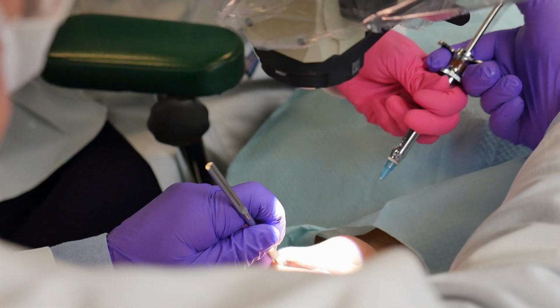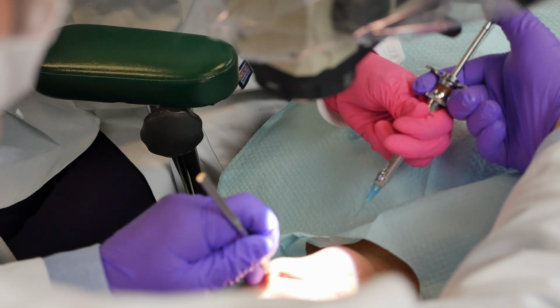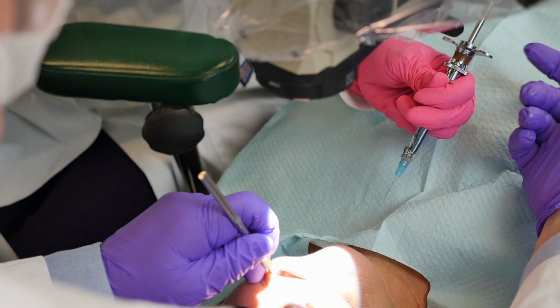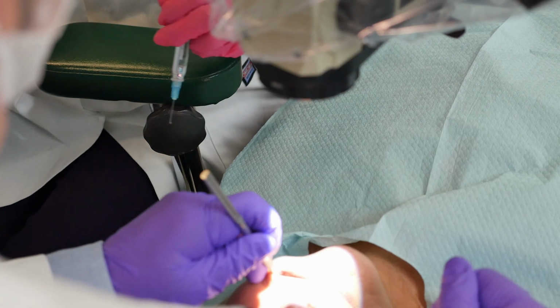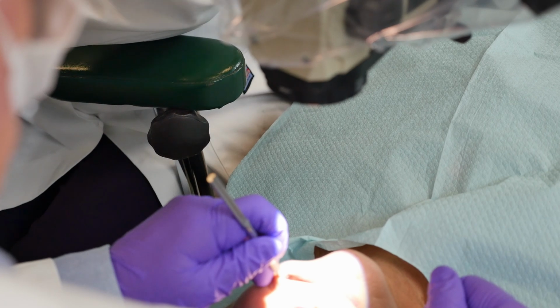If you look at the return of the syringe, here's where the error is. Now, when you look at it in slow motion, I am supposed to keep my hand steady until Joy moves. And you can actually see how when she grabs it, I am moving. So that's a mistake. And you don't uncover these mistakes unless you actually study the video. When you return the syringe, the doctor holds his or her hand steady until the assistant moves.